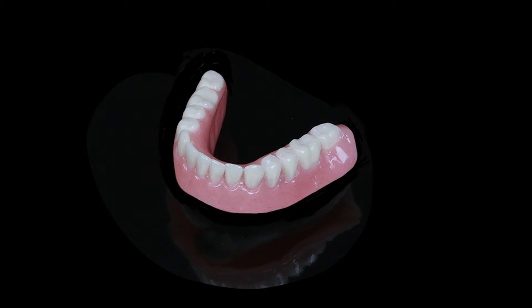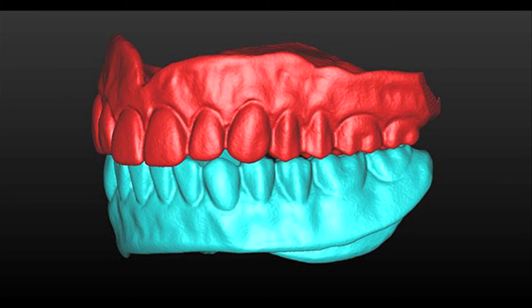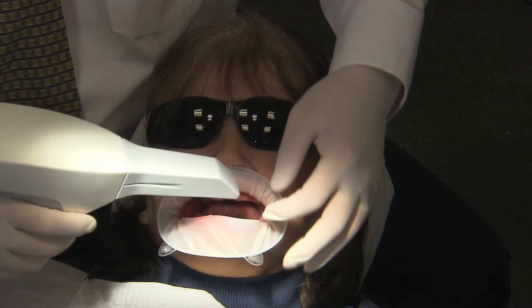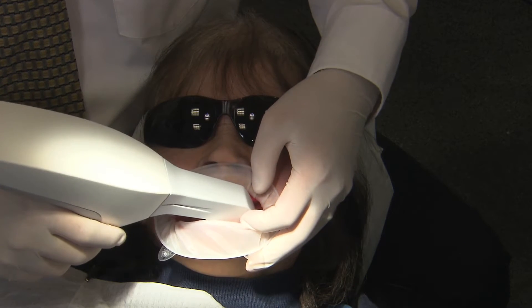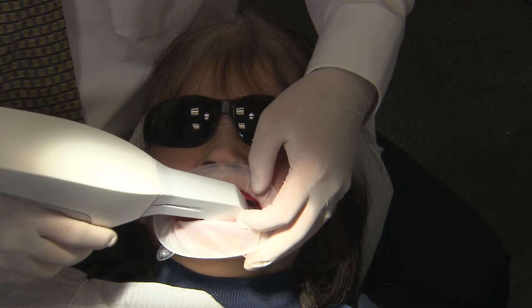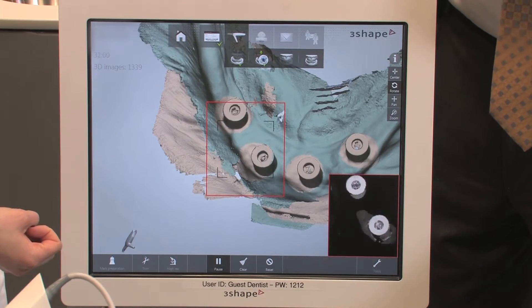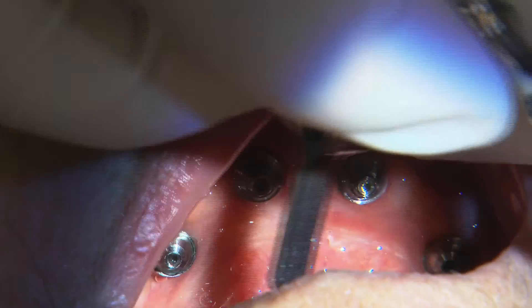The final restoration would be delivered after the implants were fully integrated. The provisional restoration was designed based on the patient's existing approved aesthetics, occlusion, and vertical dimension of occlusion. The restorative protocol used state-of-the-art techniques to improve the accuracy of implant placement, optimize function and aesthetics of the provisional, and reduce the time required for treatment.